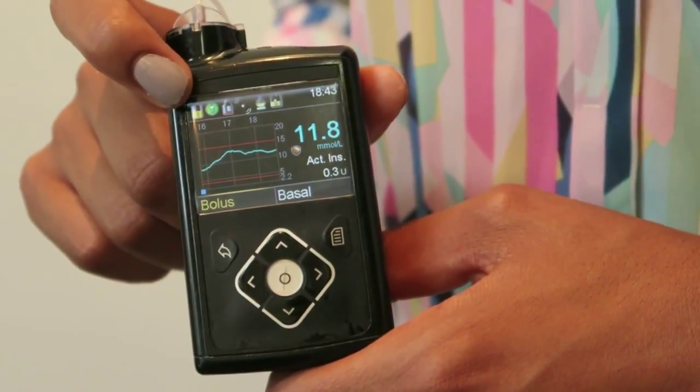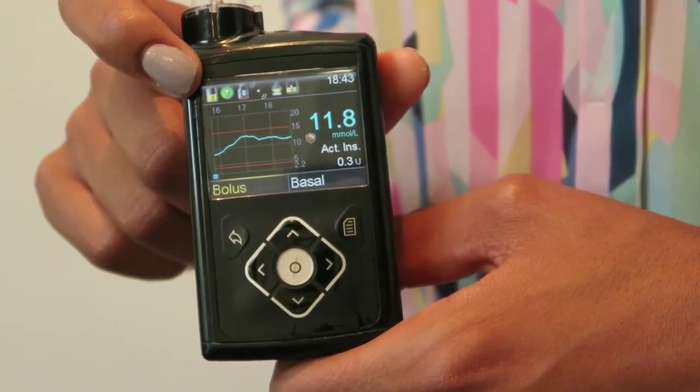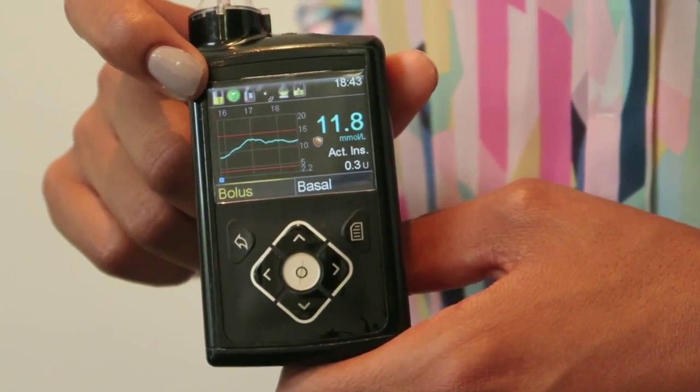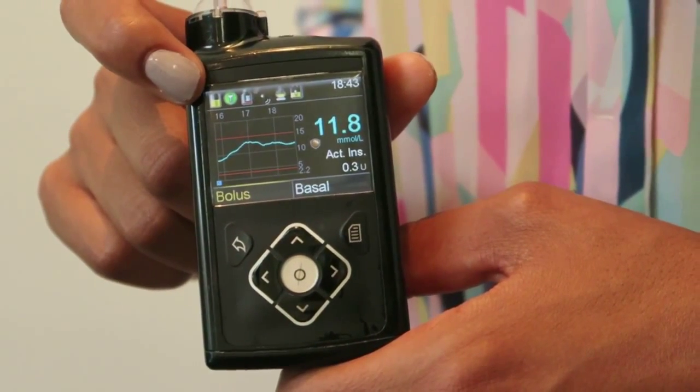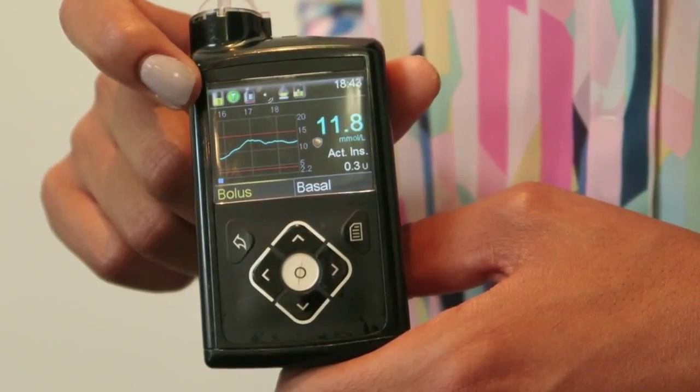You've also got a shortcut menu at the top that tells you things like how long it is until you need to change your sensor, whether it's transmitting and working properly, how much insulin you've got, and the connectivity options as well.